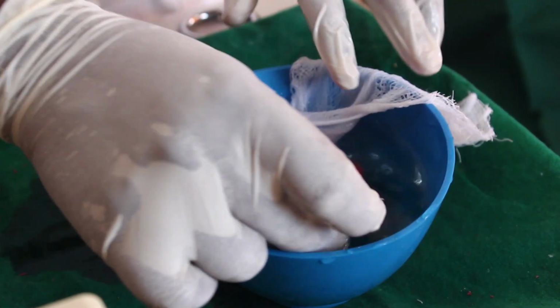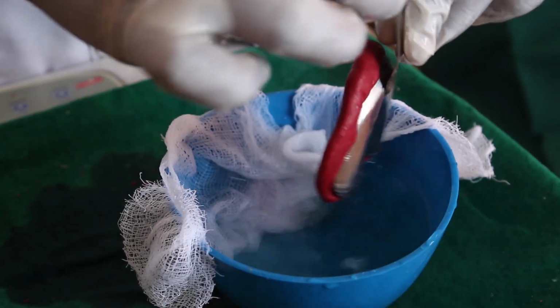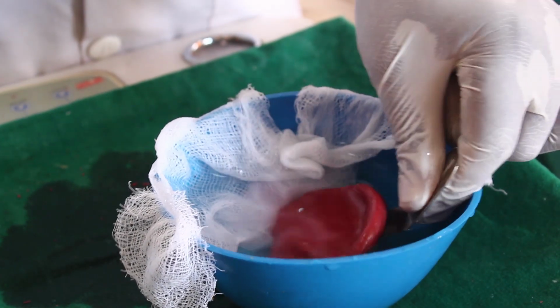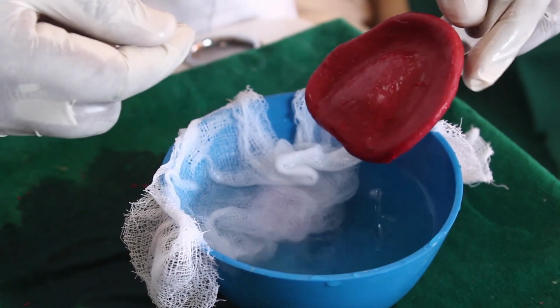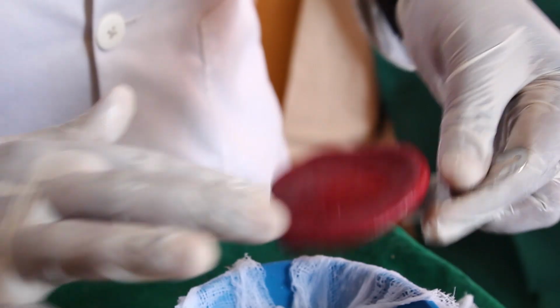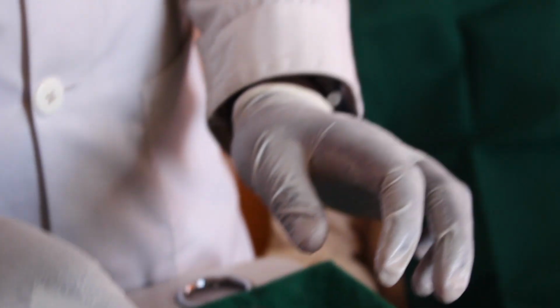If the temperature is more, then what can we do? We can do tempering, that is, flaming it with the Bunsen burner or the micro torch, then you can dip it in the hot water to prevent burning of the soft tissues. So now I have made it. So now I'm going to make the impression.